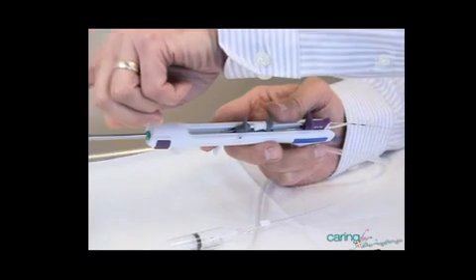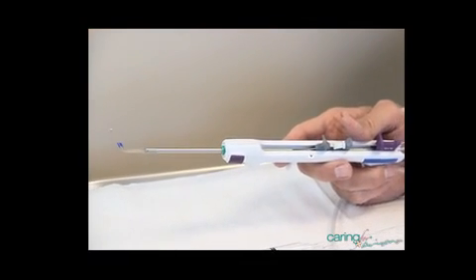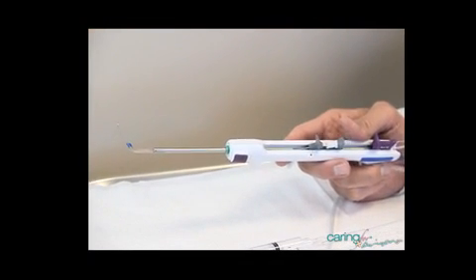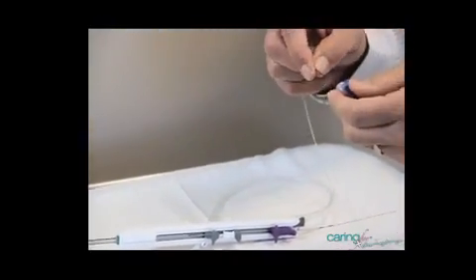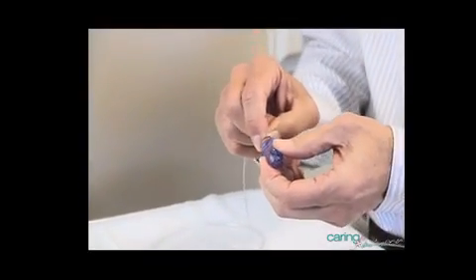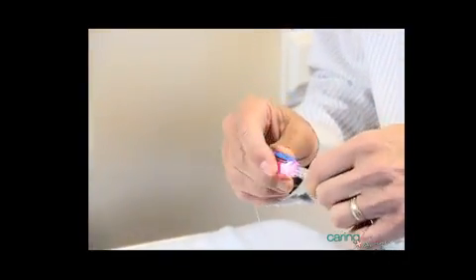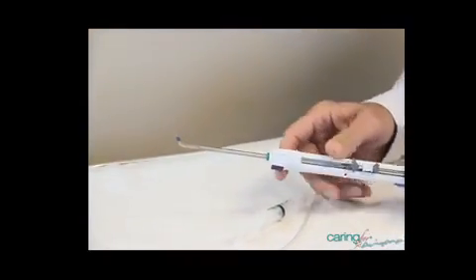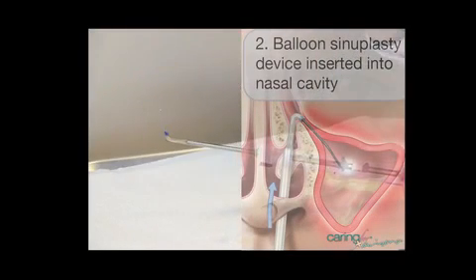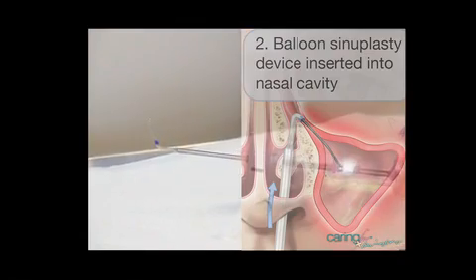This guide wire is flexible, so when it is approaching the sinus area, it's not going to traumatize the tissue and go where it shouldn't go. It goes into the sinus. Now, once we're in the sinus, we'd like to know where that wire is because it disappears. And we have a tool that will deliver light. So basically, we have a light that is coming out of the end of the fiber. And once we are in the sinus, that fiber will illuminate or shine on the cheek area or the forehead, the frontal sinus region or the maxillary sinus area.